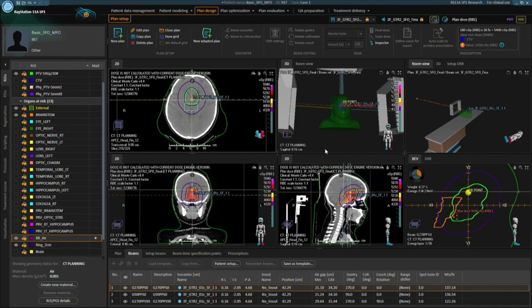Specifically this MVCT, what do you do? I mean, do you decide what kind of material you will do? Yeah, that's a good question, because if we get a metal, the artifact will be there. We observe that even if you use the correct window level, the geometrical uncertainty is going to be there.